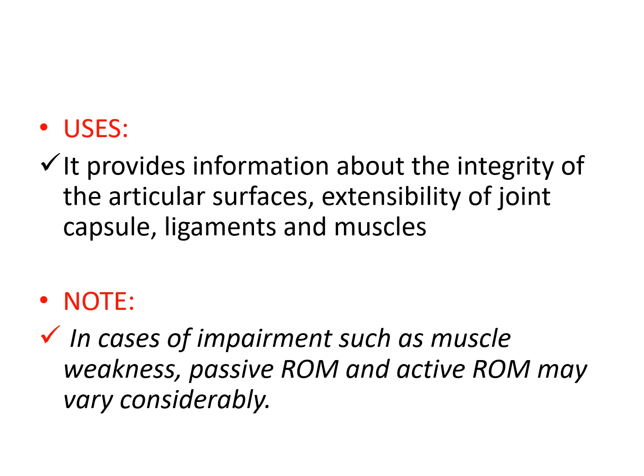Okay, so in cases of impairment such as muscle weakness, passive range of motion and active range of motion will be different. If there is muscle weakness, your active range of motion will be less. But when you're doing passive range of motion, the range of motion will increase, because the therapist is doing the movement. The therapist is pushing the joint in a particular movement. So muscle strength, even if it is poor, will not cause reduced range of motion. Okay, so these are the important concepts. If you have any doubts, you can clarify with me later.